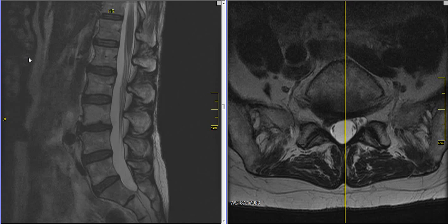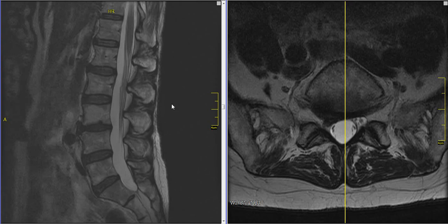Dr. Johnson here again. Today we're going to be looking at an MRI scan of the lumbar spine that is abnormal. This one shows a herniated disc or a displaced disc causing leg pain. So we're going to go through that the way we did with the normal MRI scans in the other videos in this series.